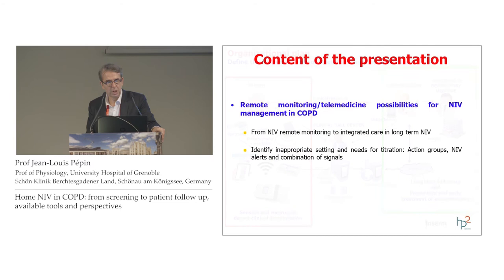Regarding the long-term follow-up, we will see that if you have a significant number of patients to follow, NIV remote monitoring is very useful to organize and to integrate care for long-term NIV. You also have some tools to identify inappropriate settings, residual events, needs for titration, and we will discuss action groups, NIV alerts, and combination of signals.